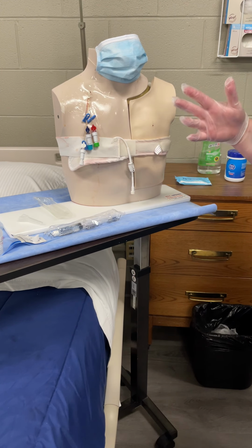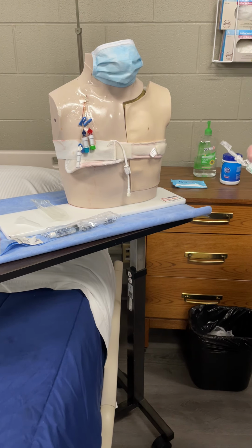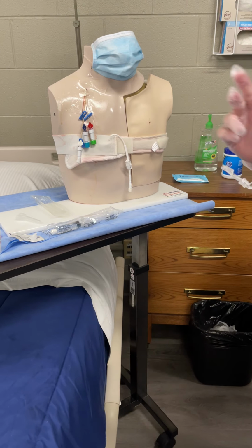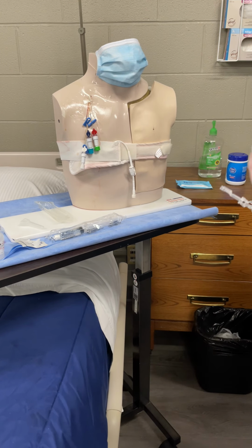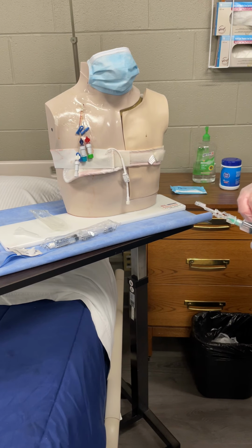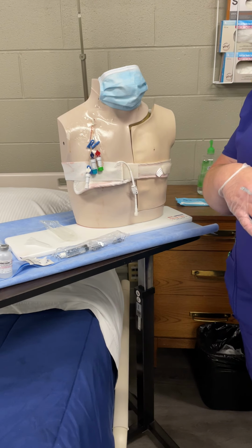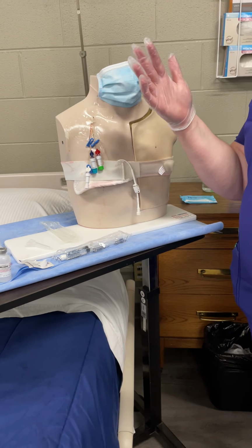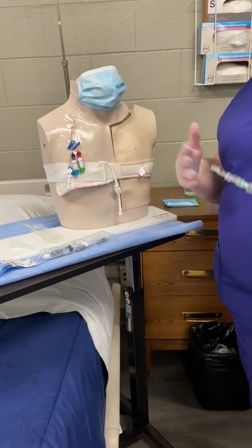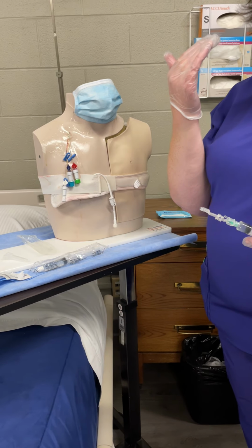Now, if you're drawing up other meds in the med room, it's always good practice to even label this. Put the patient's room number, their initials, and how much medicine it is, like even a piece of tape that says JS room 24 Lasix 20 milligrams. That way you know, because a lot of times there are a lot of different meds that you're giving through their IV. So knowing which one, and then remember how long or how fast you've got to push it. Does that make sense?